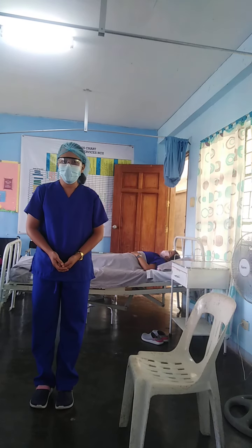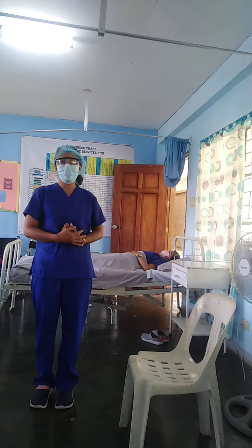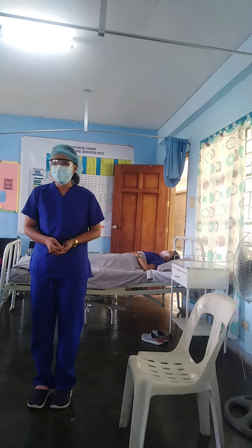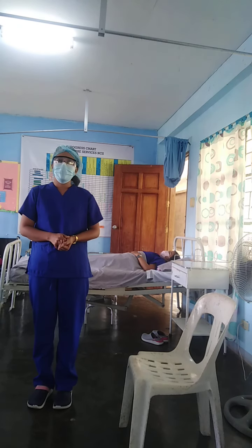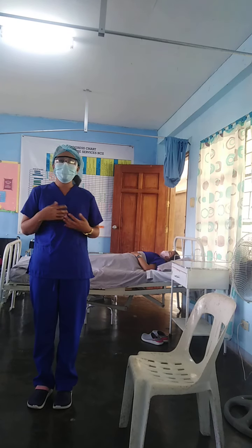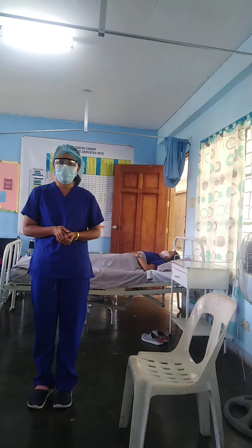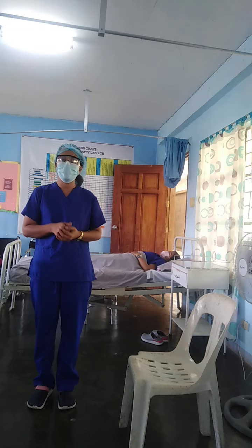Good morning, ma'am. I'm Honeybelle Rabanal, your healthcare staff for today. I will perform assisting patient in mobility.